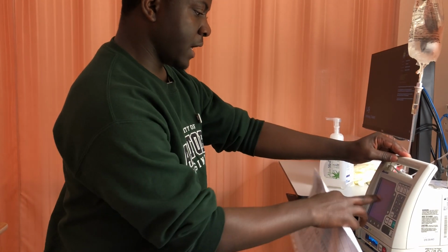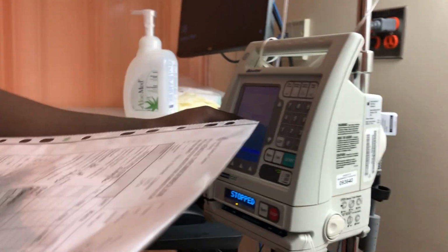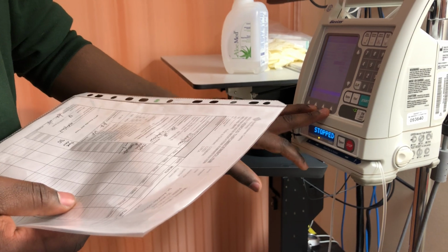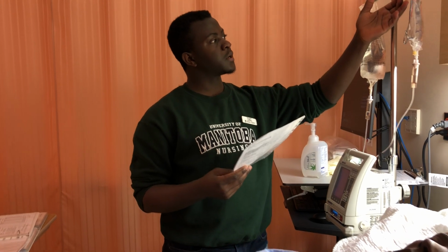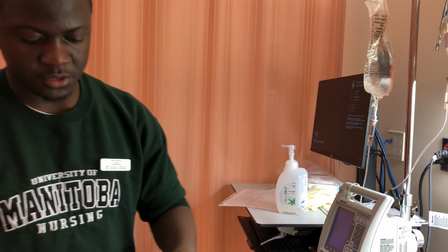So I'll put my rate here, 1350 units per hour, and at that dose the rate will be 13.5 milliliters per hour. So I have that already, and I can confirm my primary. And just before I start my IV, I will go over my checking, making sure I check the patient and the bag. It's heparin, 25,000 units, 100 units per ml, and I basically go over all the checks again.